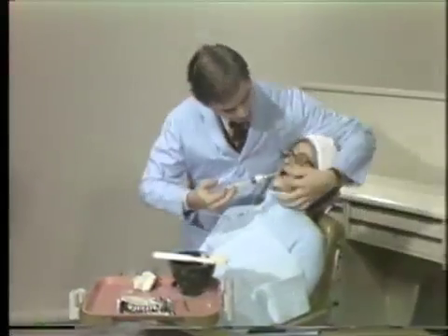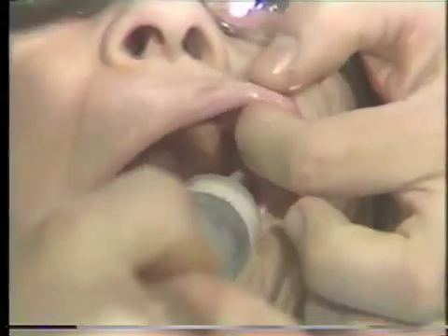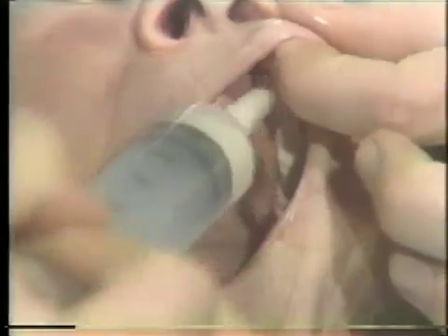We apply the alginate material intra-orally, first starting in the posterior region and working forward. Do both sides.